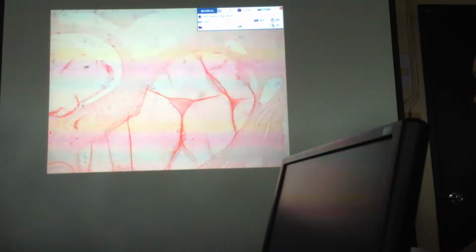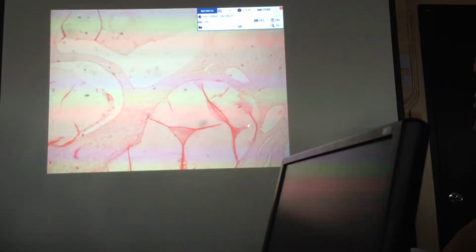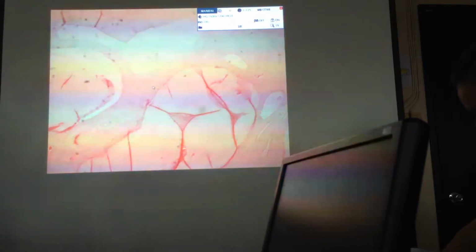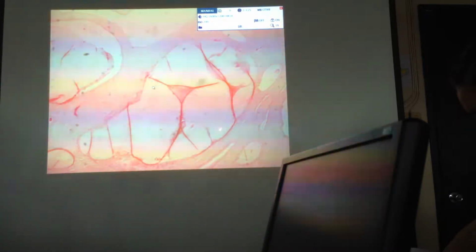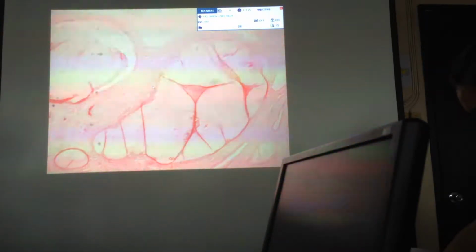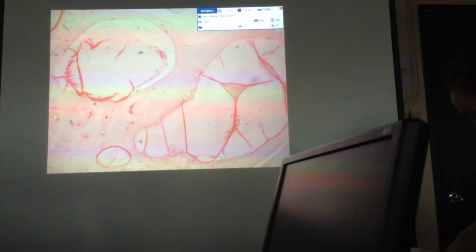If you have dilated glands like this one, that would be attributed to environmental change. And there's entrapment of the mucus. These are called the Nabothian cysts. Okay. Nabasa niyo ba yun? Nabothian cysts.